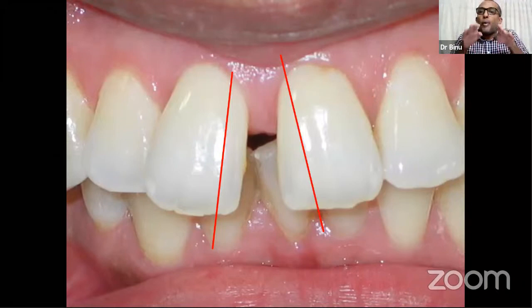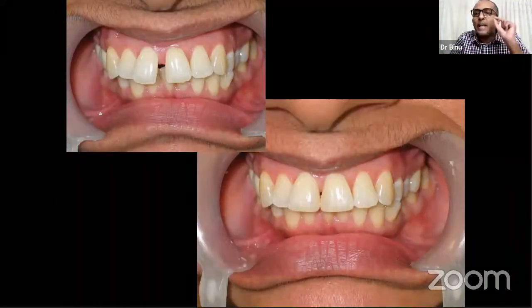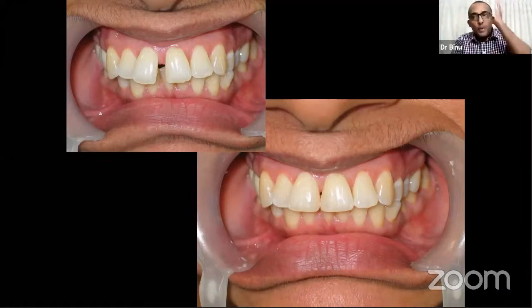That is why you feel the gap as well as slanting. It's a visual perspective, where the line of light reflection is. So when you do a composite filling, do not change the line of light reflection. Keep it right there and try to make it straighter. It won't look that wide.